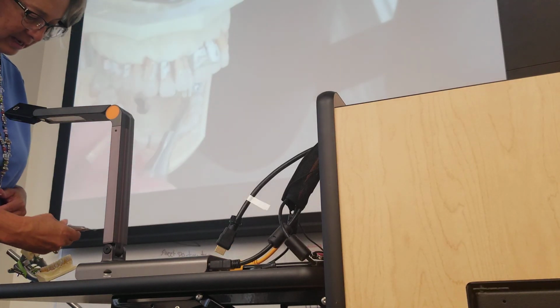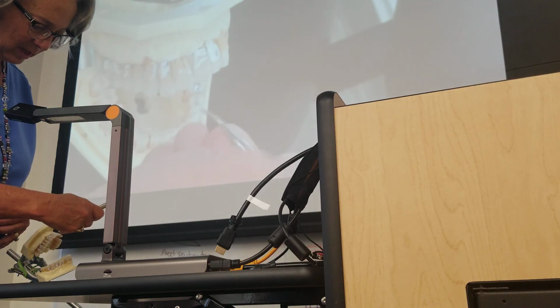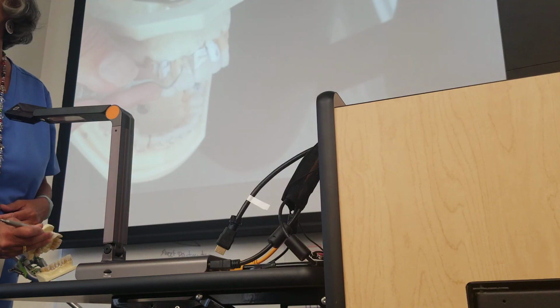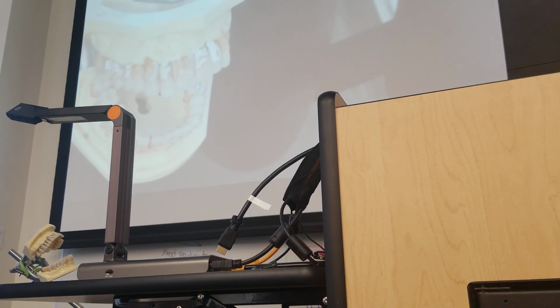let's do anterior, surfaces away. Then you're going to have to flip it to do the horizontal. Okay. And no oblique. Flip the whole instrument. No oblique on the anterior, just horizontal. Okay, did you guys hear that? No oblique, just horizontal on the anteriors.